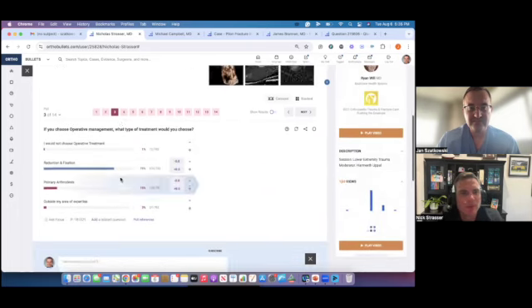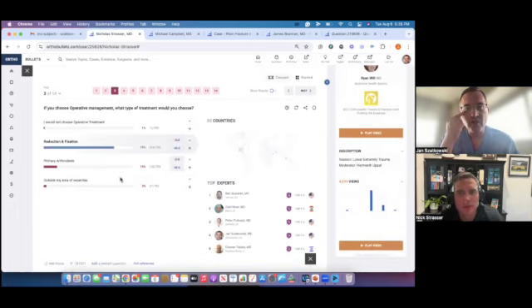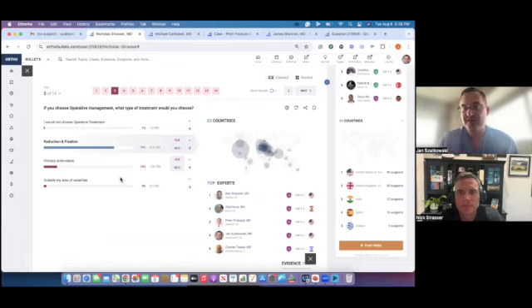That's for sure. But I'm with you, I go back and forth whether to fuse or fix. It's hard for me to fuse a really young person, and so I go back and forth still. I know that some of the data suggests it's fine, but fusing a 21-year-old who was in a high-speed MVA, if there's any comminution, I find it more difficult to align the foot. If there's comminution of the metatarsal associated with it, not a purely ligamentous injury, exactly.